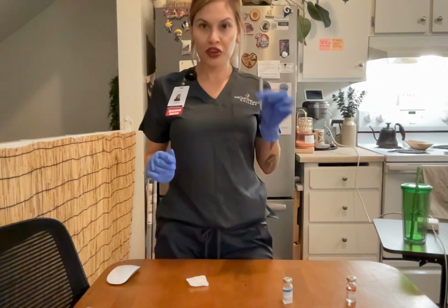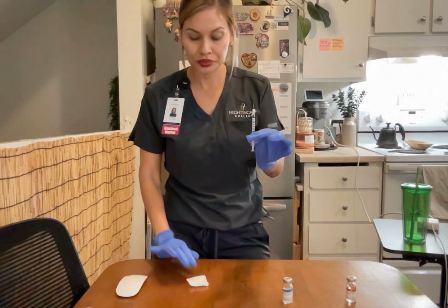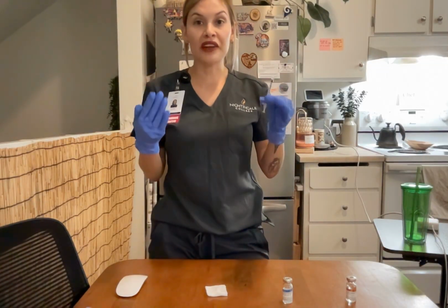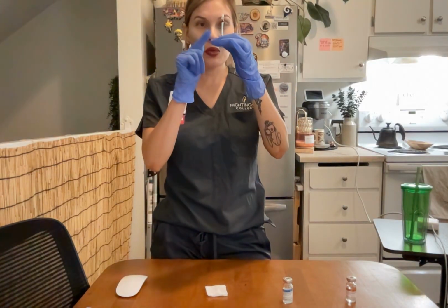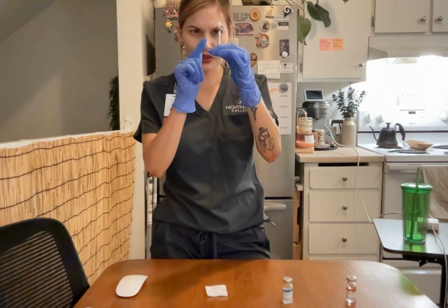Now I'm going to check and verify in the EHR or in the MAR that the correct prescribed order of regular insulin is 4 units. I check again on my syringe. I make sure that I have 4 units of regular insulin.